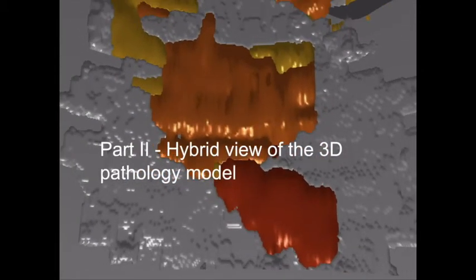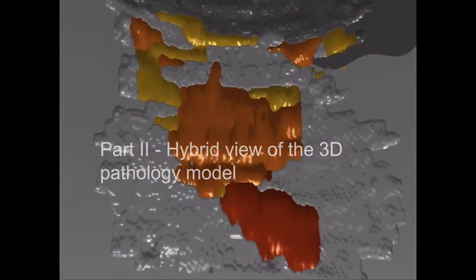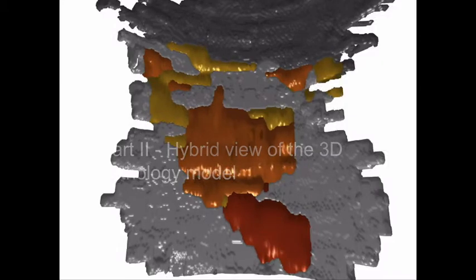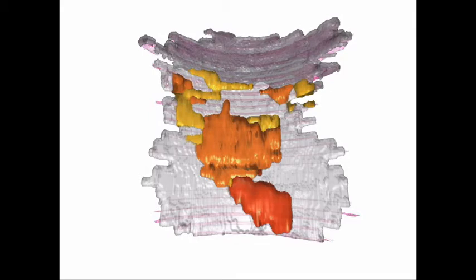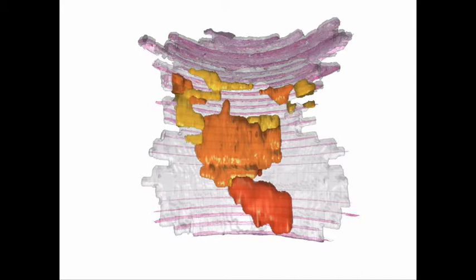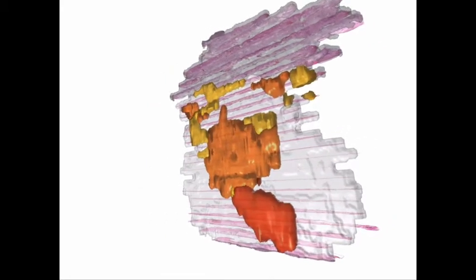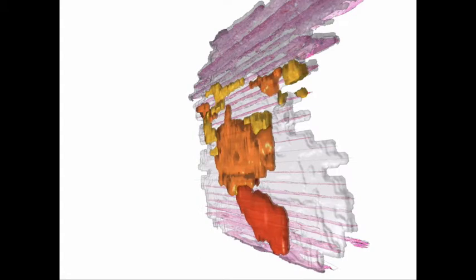In part two of the video, the specimen is extracted from the virtual esophagus. A semi-transparent 3D pathology model and the underlying histological sections are overlaid to give a hybrid view of the specimen. This can be used for several purposes, for example within an interdisciplinary conference to give a spatial impression of the resection specimen.